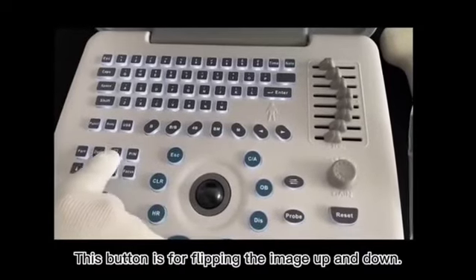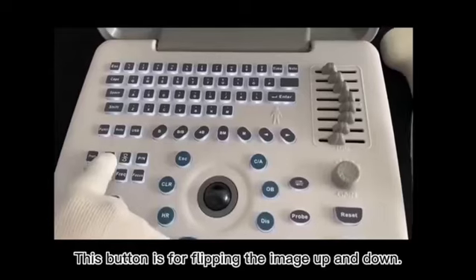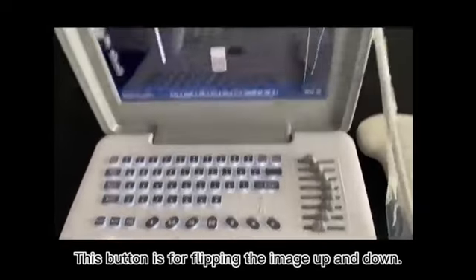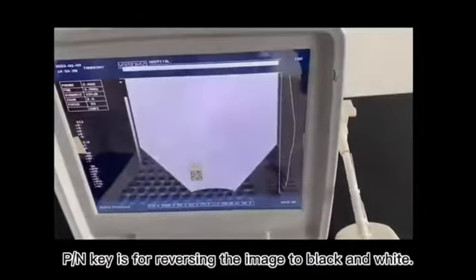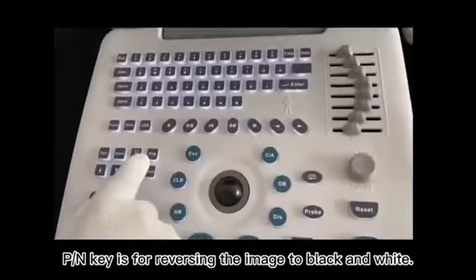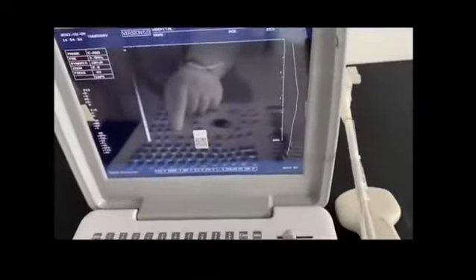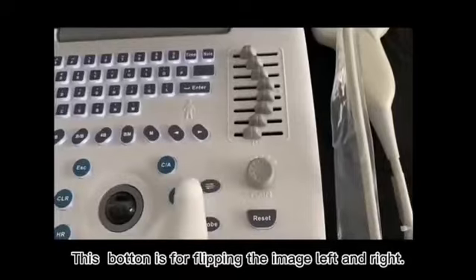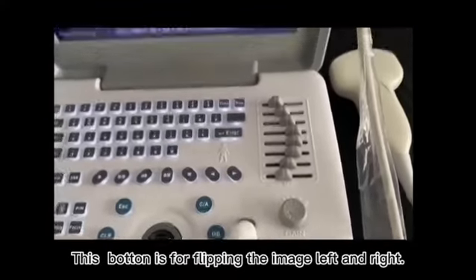This button is for flipping the image up and down. N key is for reversing the image to black and white. This button can flip an image left and right.